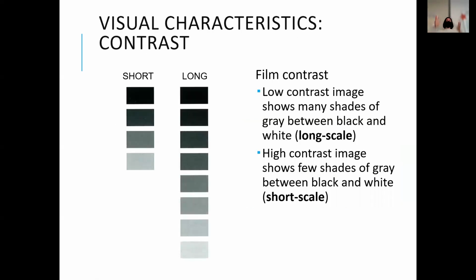So there are two scales: the long scale and the short scale, and the contrast for the low contrast.